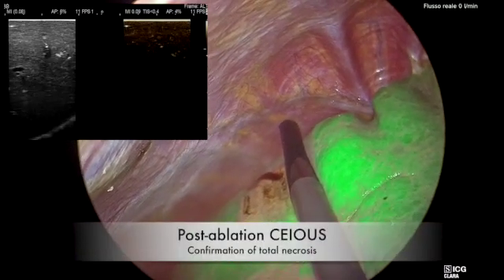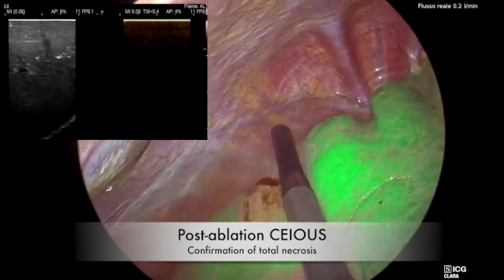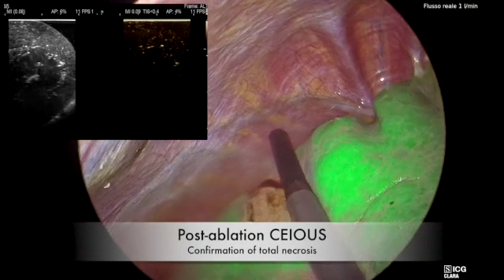After a few minutes, we repeated the ultrasound evaluation with contrast media. Non-enhancement has been visualized both in the lesion and in the surrounding liver parenchyma.